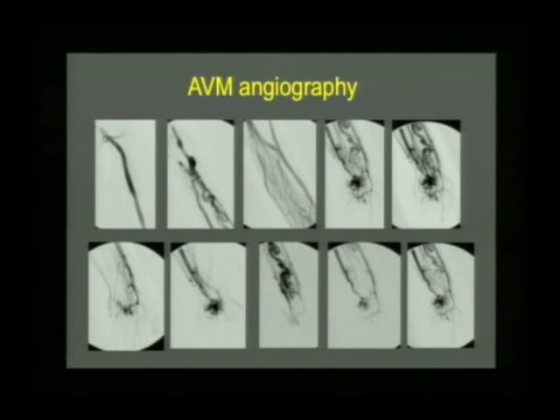If you're doing these in babies, you always risk the problem with small vessels and injury to small vessels. You want to keep your portal patent. You want to keep those access sites patent, so you do not want to do unnecessary angiography on any child of any age.